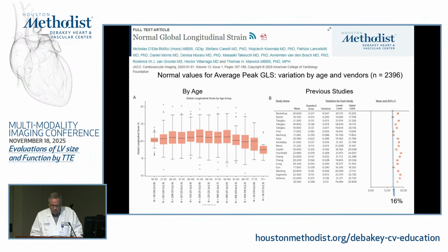And a couple of things that they first do is they talk about, okay, so first of all, the technology. It's not perfect. And there are times when the strain curves don't come out as good as we would like them to. So the document talks about what we should do, what to pay attention to, to try to decide whether the strain we are getting is properly measured, properly recorded, or should we throw it away.